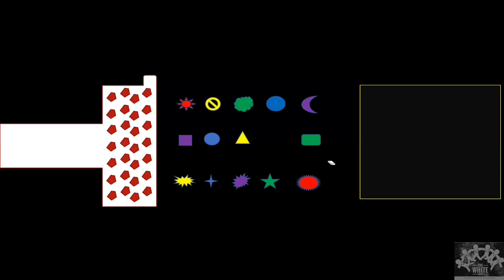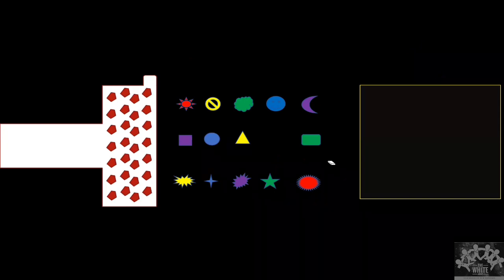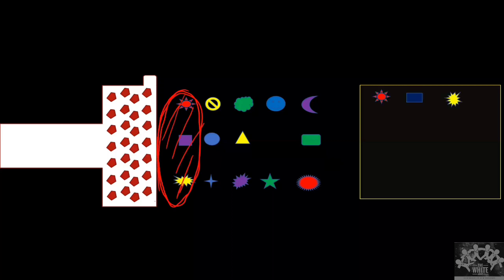Now, what exactly happens here is, whenever I stimulate the ultrasound, the piezoelectric crystal sends ultrasound and receives the echo back. Whatever echo is received back gives us the total amplitude of the sound coming from here. It receives sound from all these structures, the star, the box, and the star. So all the structures give one amplitude, and that's what I measure. I get one line.